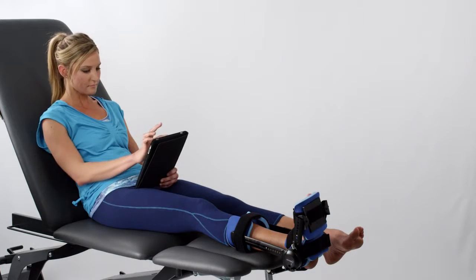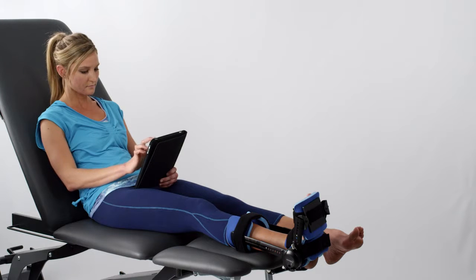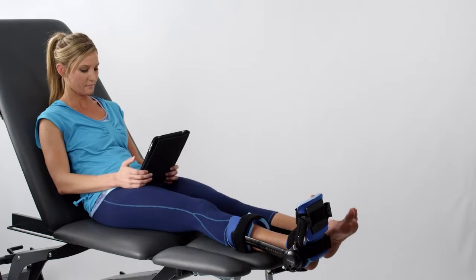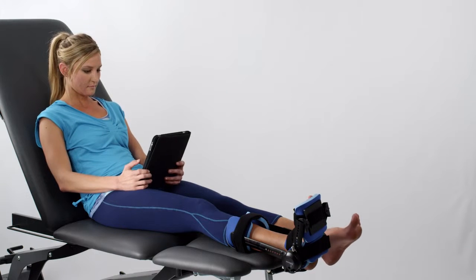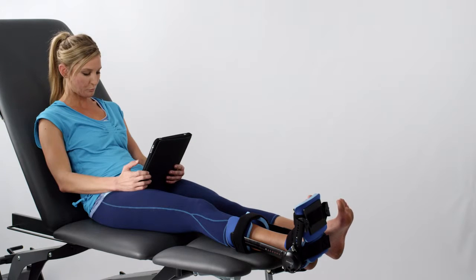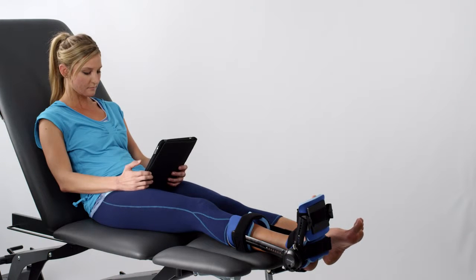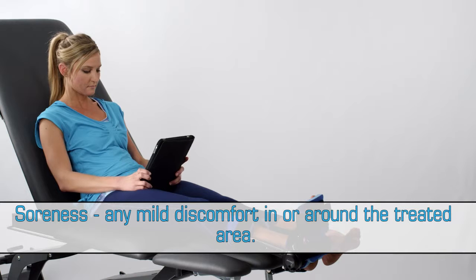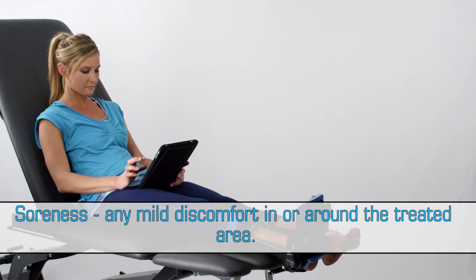Ideally, the patient should progress to the maximum wear time set by a physician or skilled therapist and be worn at rest or sleep and in compliance with the following post-wear criteria. The patient should not experience any additional soreness or stiffness from wearing the orthosis for more than 1 hour following removal of the device. Soreness is defined as any mild discomfort in or around the treated area.